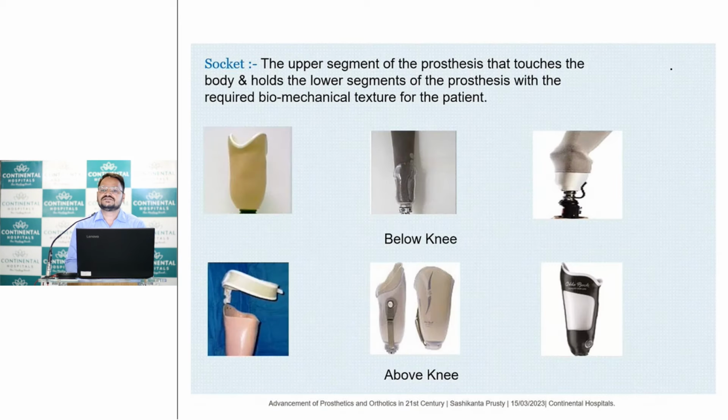Now the socket, this is a very important part of a prosthesis, because whatever technology you use for the joint or foot, that is not the part that is touching your body. What is touching the body is the socket, and if that is not comfortable, whatever you put at the distal end will not be helpful.